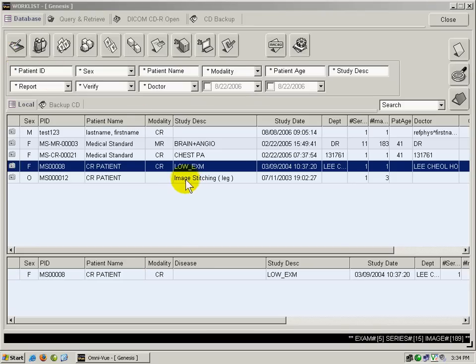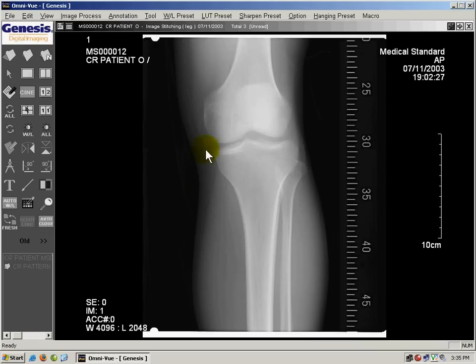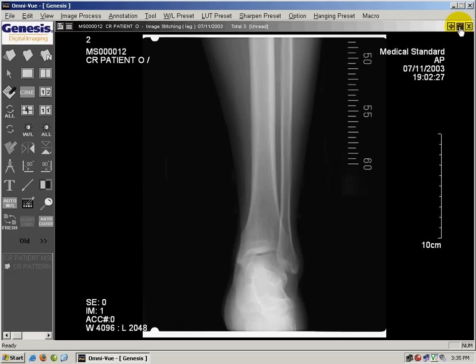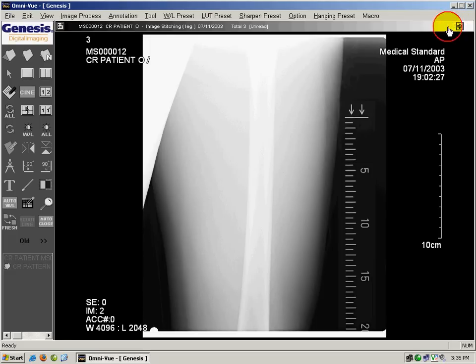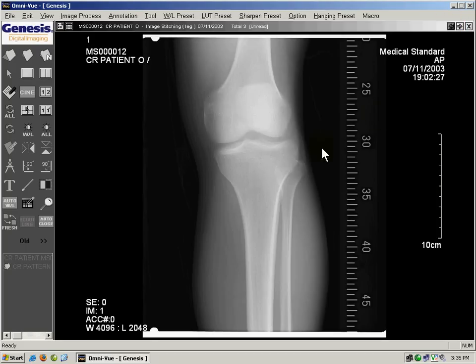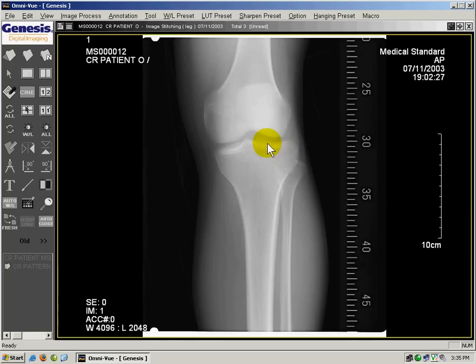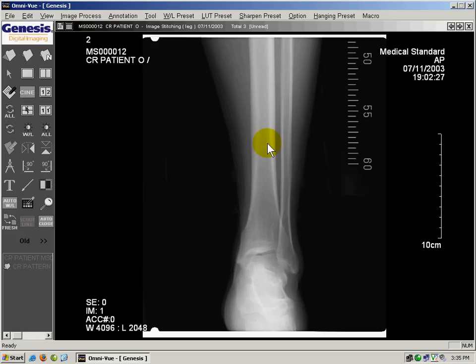I'm going to close this and go back to the work list. Now I'm going to open an exam that has multiple images — I'm going to double click on this. This is a series of three images, and you can use the arrows up here to go to the next image and go back. Also, if you have a wheel mouse, you can click on the image and roll your mouse button to go to the next image.